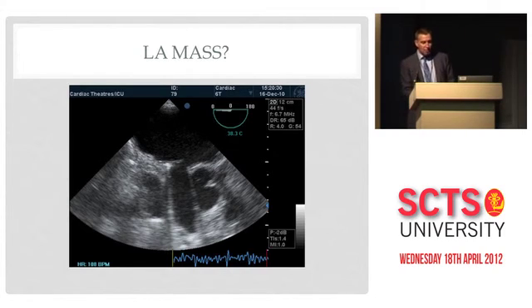Sean showed us one of these before. This is something else that happens in the left atrium, and left atrial air, as this obviously is. It's something that's taken the surgeons a while to appreciate, I think, with echo, but now they're right onto it, and they try and get rid of this mass, this air. I mean, it's not something they can diathermy or cut out, so they have to syringe it out.